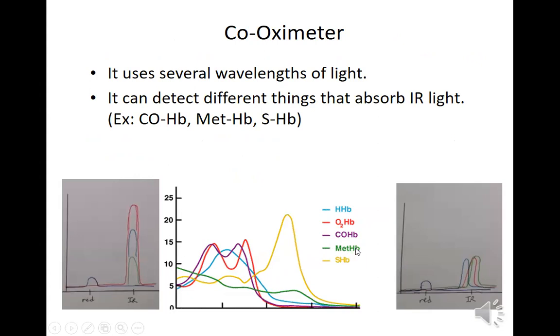So the other big problem with using the pulse oximeter versus the arterial blood gas is anemia, right? That's the one you really have to watch out for. And that's why it's important that you get that hemoglobin number. Make sure it's between 12 and 17 or whatever, male or female.